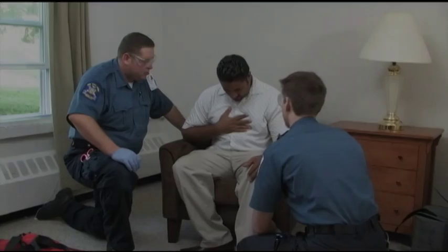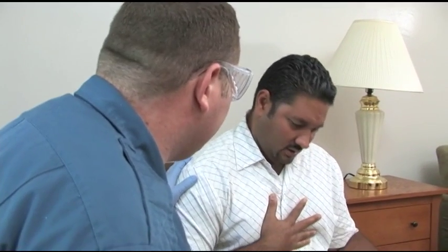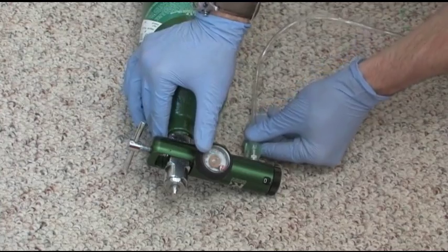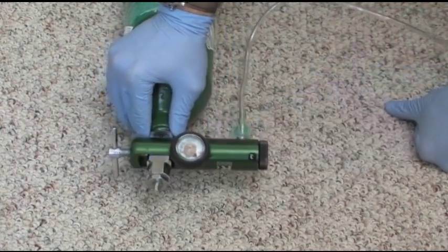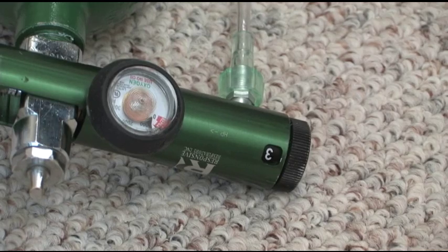Now let's take a look at the basic steps that you can expect to follow when using this method of oxygen delivery. Before applying the nasal cannula, explain the need for oxygen administration to the patient. Attach the nasal cannula tubing to the nipple of the regulator. Set the liter flow between 1 and 6 liters per minute. The flow rate will depend upon the patient's condition, local protocols, or orders from medical direction.